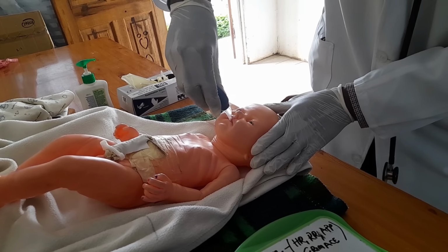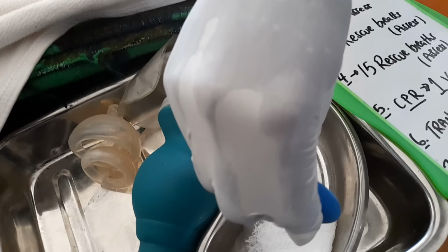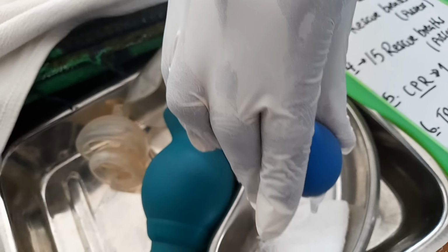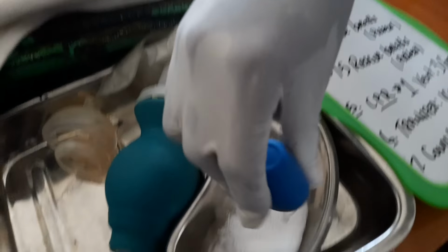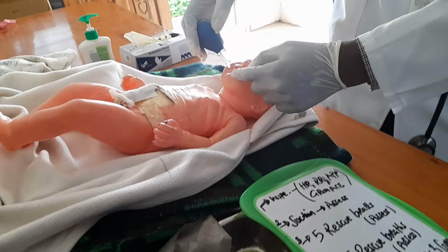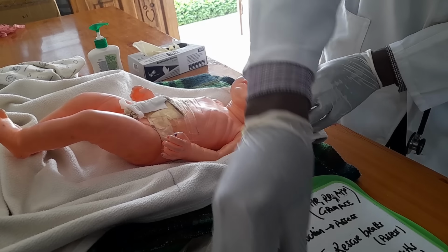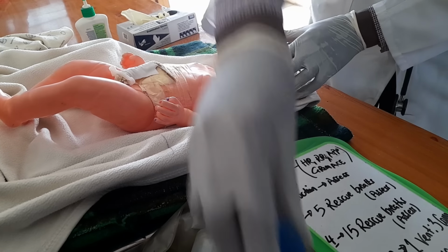When you press it and then release, meaning it has sucked, then you go to a receiver there and remove. Just do that. When you do that, it will come out. Then again, when you do that, meaning it's ready to suck, you take it back, maybe even twice. You do that and then let go, meaning it has sucked. So after suctioning the mouth, you have to go now to the nostrils. There you do the same. Again here, you compress, it will suck, then you release from there.